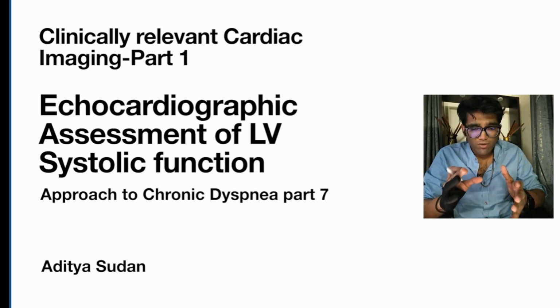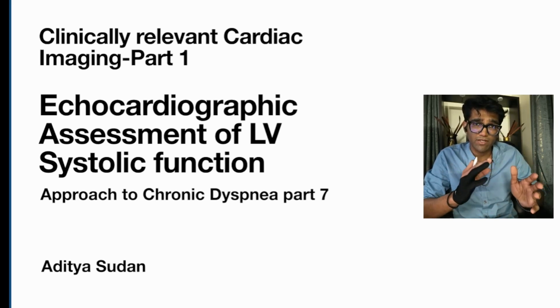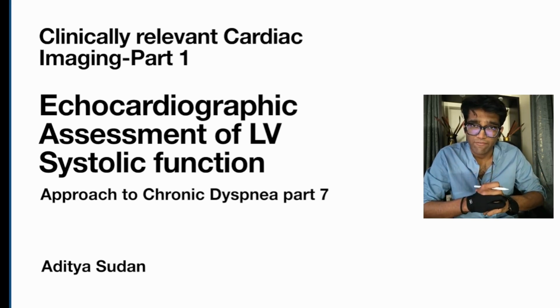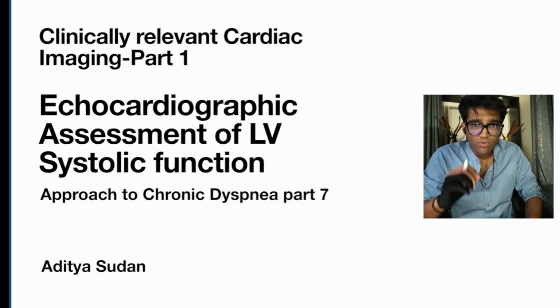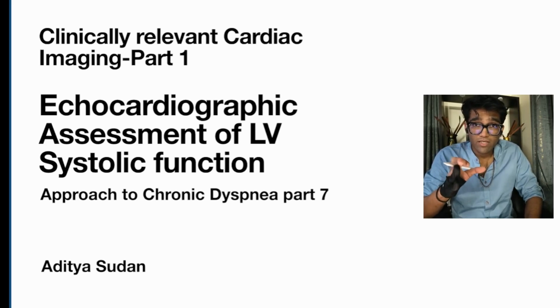At this point, you have a fairly good idea about the patient's likely tissue distribution of pathology, and you have diagnostic frameworks that allow you to analyze and dissect your way through the likely physiological abnormalities that the respiratory or the cardiovascular system have. However, there is another modality, that is 2D echocardiography, that allows you to further dissect through the intricacies of the physiological abnormalities in the cardiovascular system.